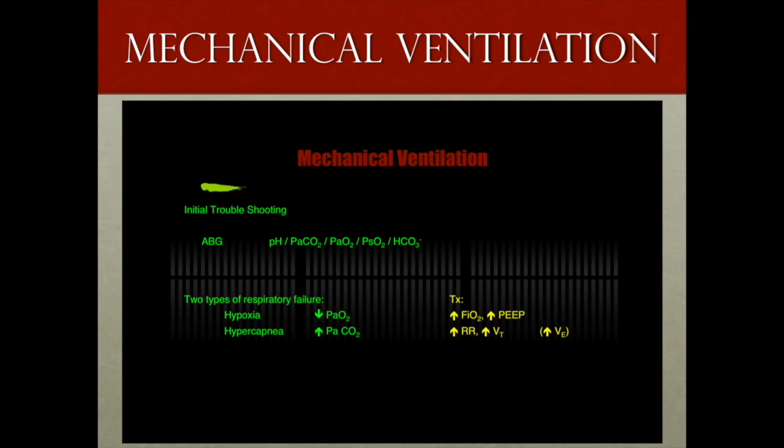Hypercapnia or increased PaCO2 is treated by increasing your minute ventilation, and this can be done by increasing the respiratory rate or the tidal volume.